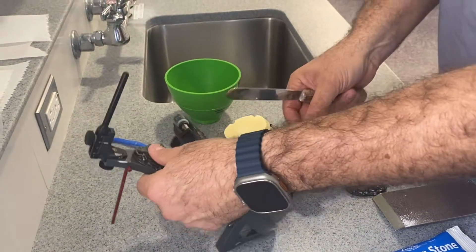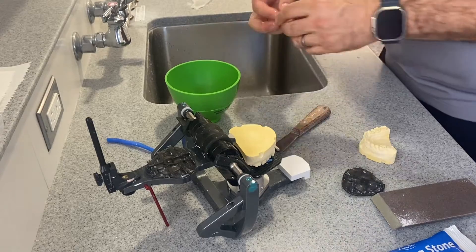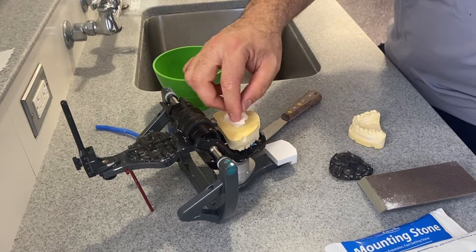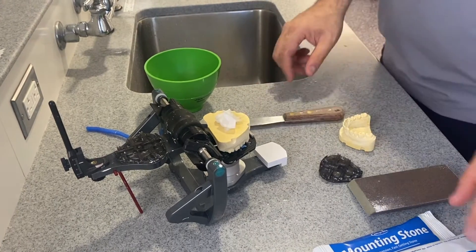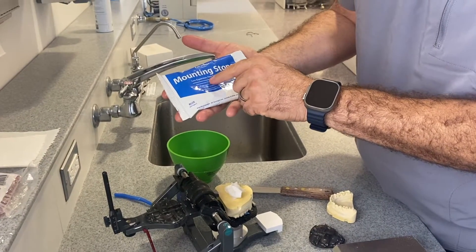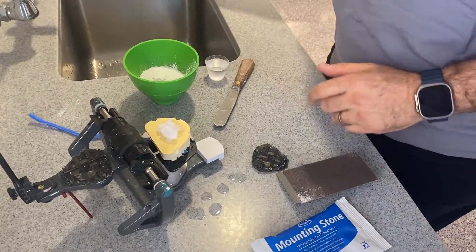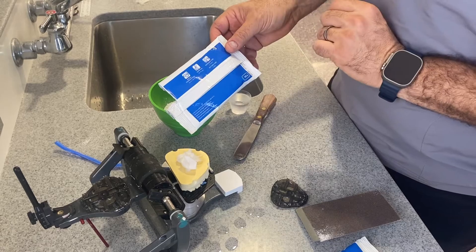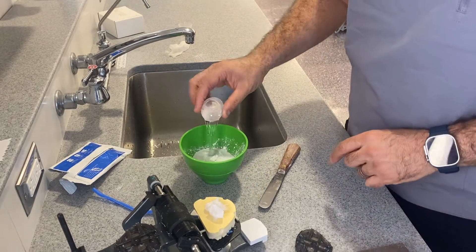When we mount the upper, a very important thing is we need to wet this surface. If I don't wet that surface, the mounting stone is going to absorb my mixing. This is a low expansion, fast setting stone. It says 26 milliliters per 100 grams. This is 100 grams, so pretty much one of these cups is about 26 milliliters.